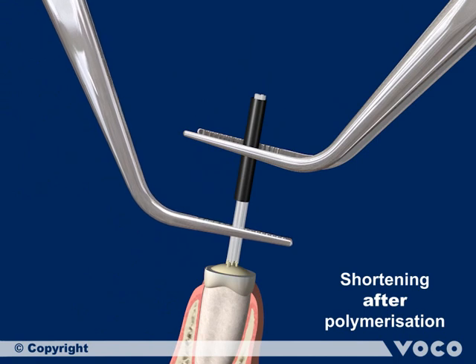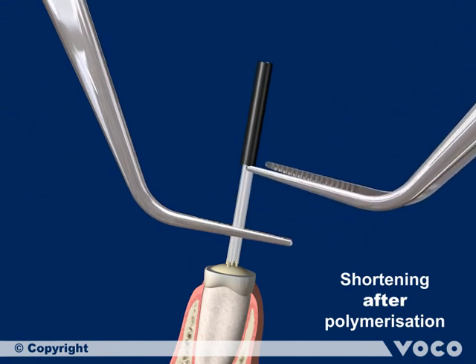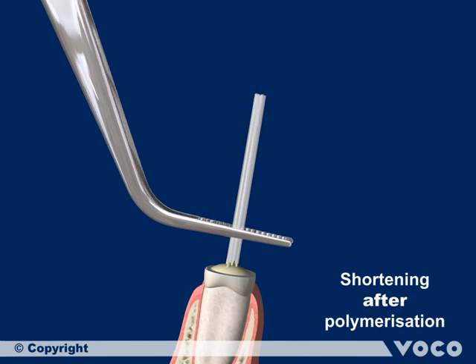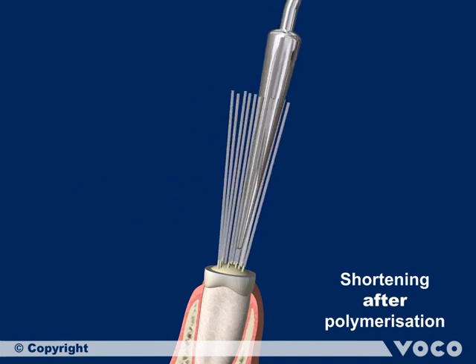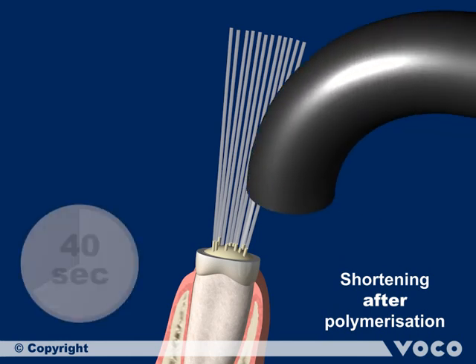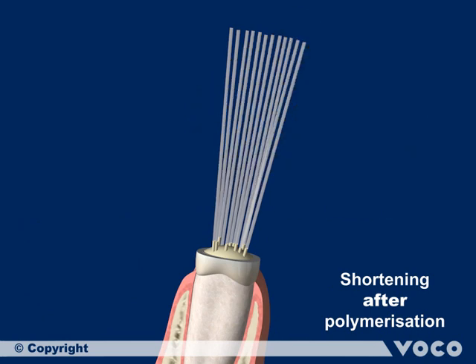Hold the inserted Rebuilder Post GT in place. Then, using another pair of tweezers, remove the colored sleeve from the post. Spread the single posts of the Rebuilder Post GT with a spreader or another suitable instrument, e.g. a closed pair of tweezers. Set the single posts in place with an initial light curing for 40 seconds.